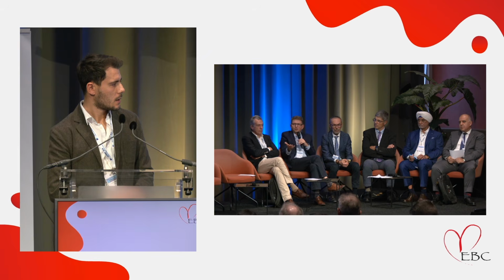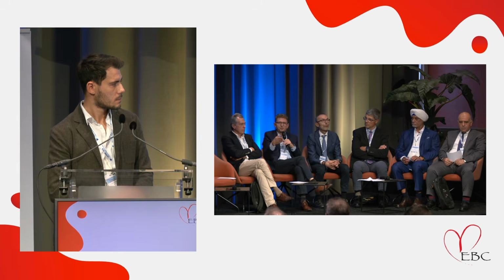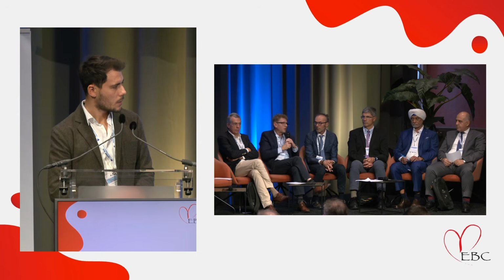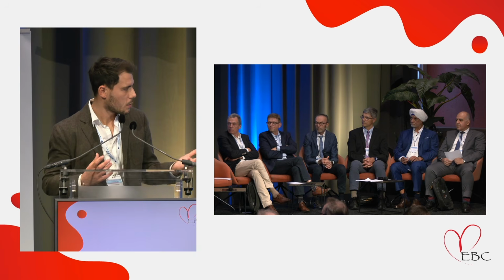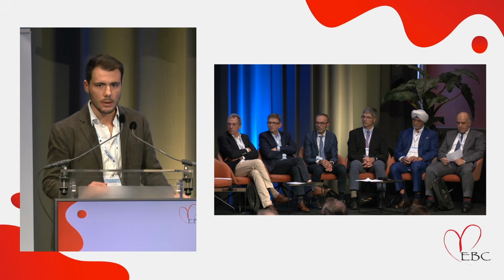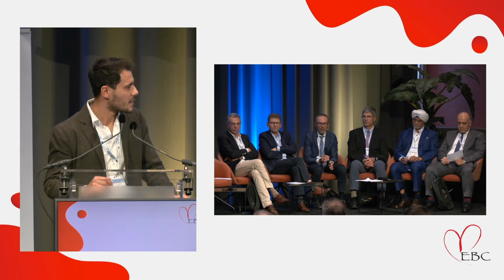And then, of course, the solution is you must use imaging, because you don't know if the protrusion is the whole part of the stent, then you can use Culotte as you did. If there's just partial protrusion, the only thing to do is to crush the stent, as you mentioned before. And I think a third comment is the potential elongation of the stent. In this case, even if you are very precise, you may have an elongation of the stent, so protruding the stent even if you are very, very good.